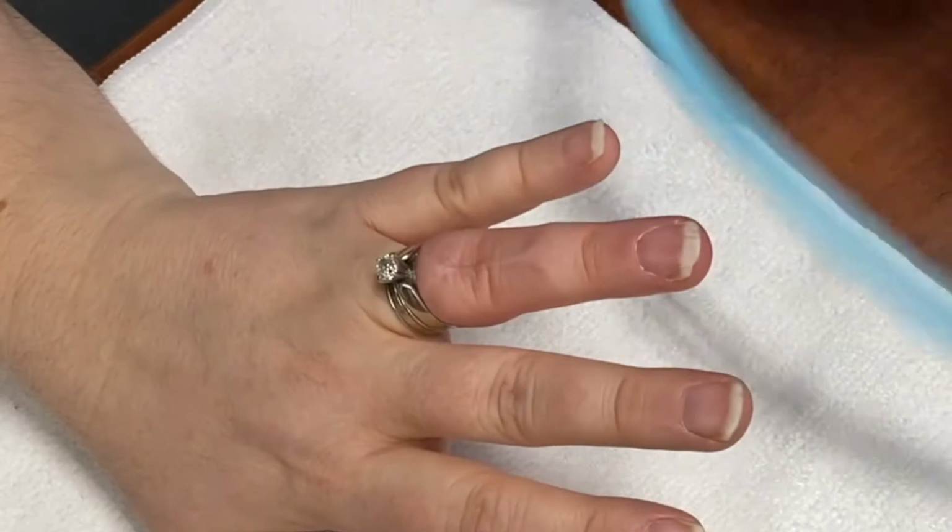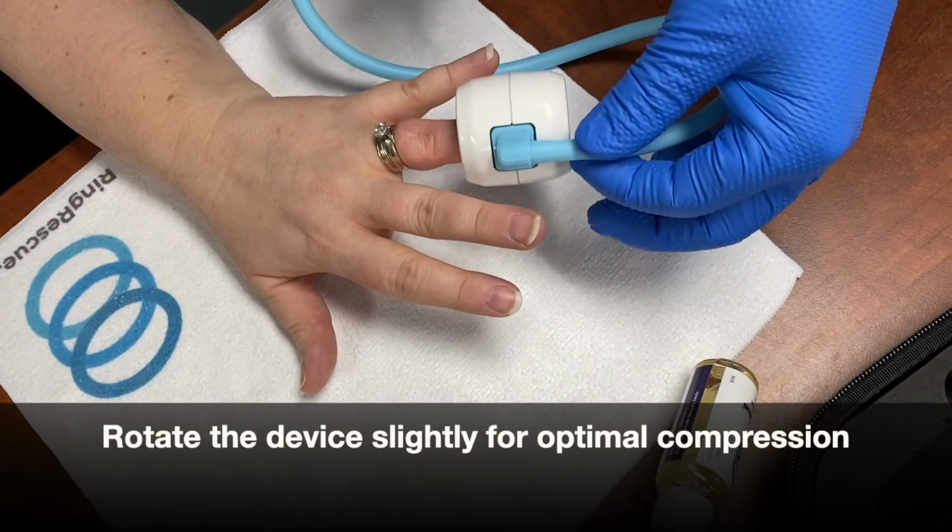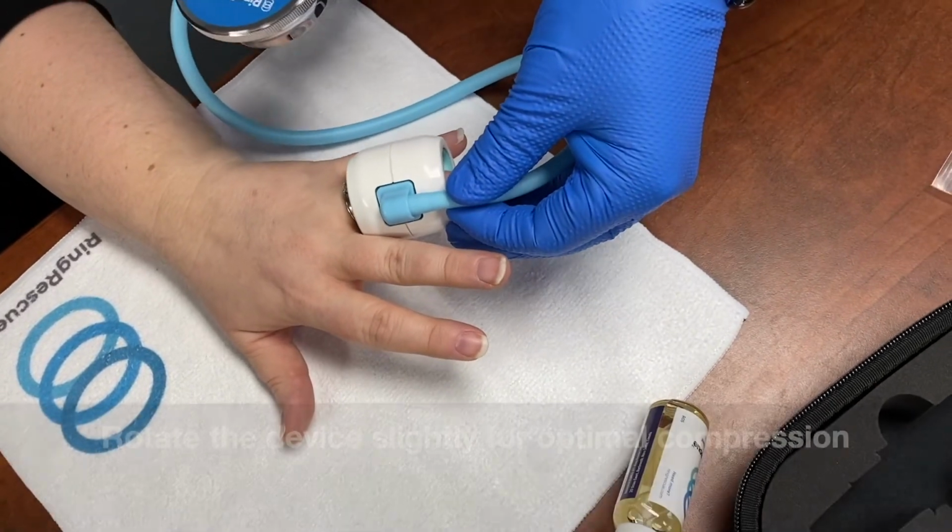And so what we're going to do is I'm just going to put the cuff back on, but I don't want to put it on exactly the same spot. I want to actually compress across that seam. So I'm just going to rotate the cuff a little bit, put it back on like that.